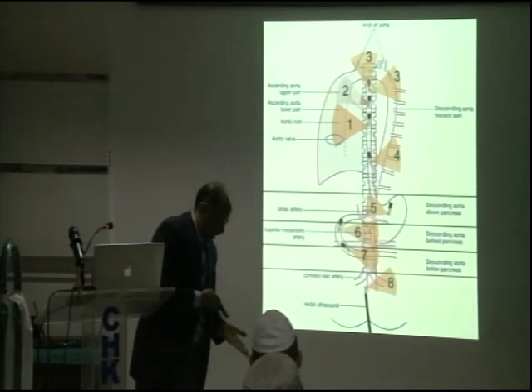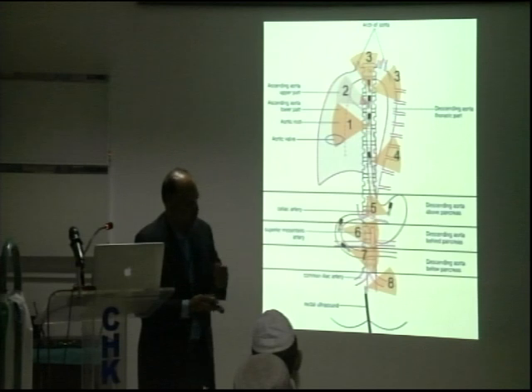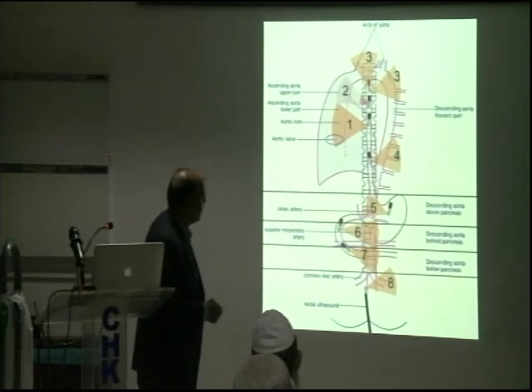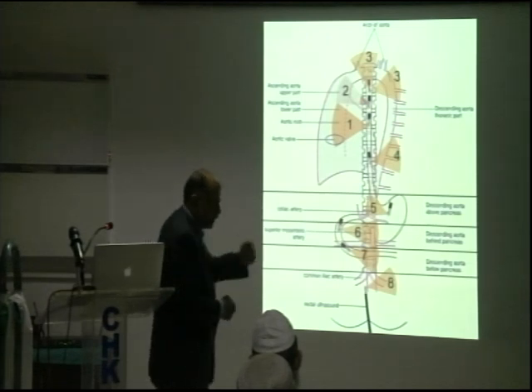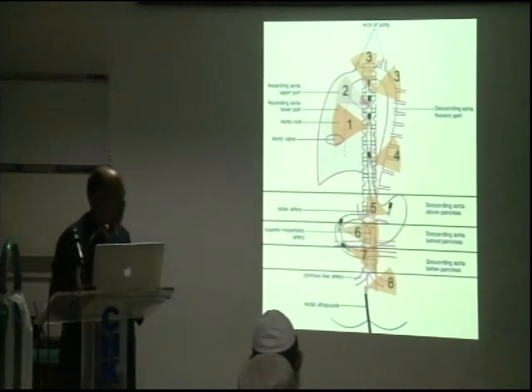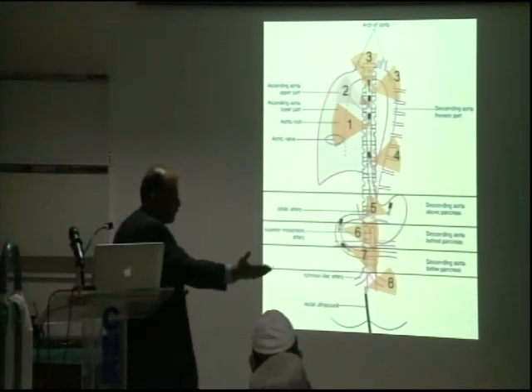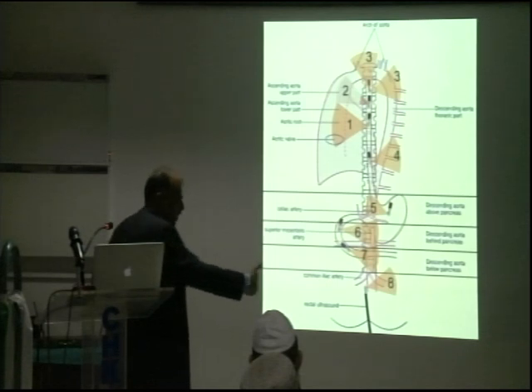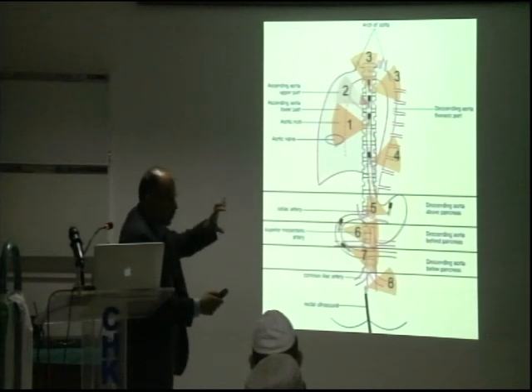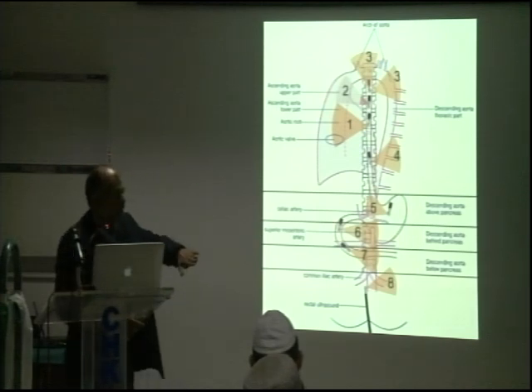If the scope is facing anteriorly and you move, let's say, clockwise, where would the scope face? Let's suppose you're here. That part I understand, but I just wanted to say that initially, once we've got the scope inside, the transducer is actually facing the sternum. That's true, depending on how you introduce it. As Dr. Khalid has told you, if you're introducing it, yes, it would be facing anterior, the sternum. But if you rotate and you have the aorta in view, then it is facing posterior, when you bring the aorta in view.